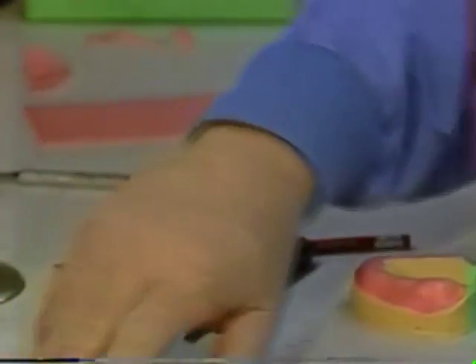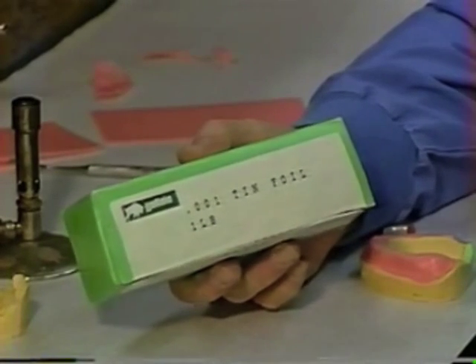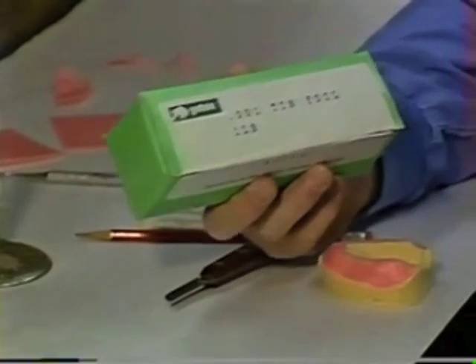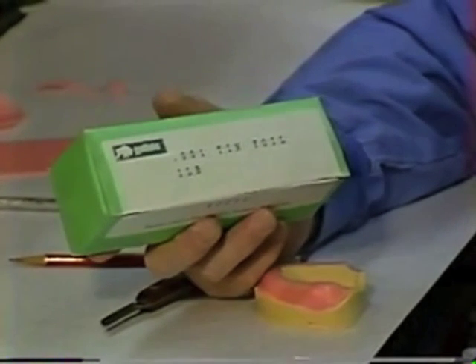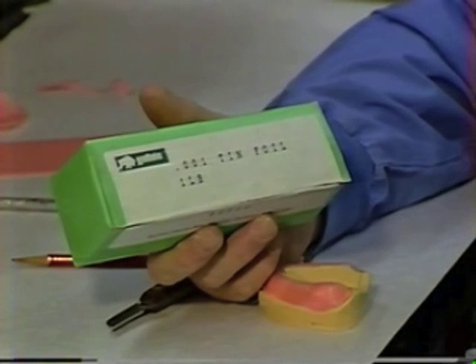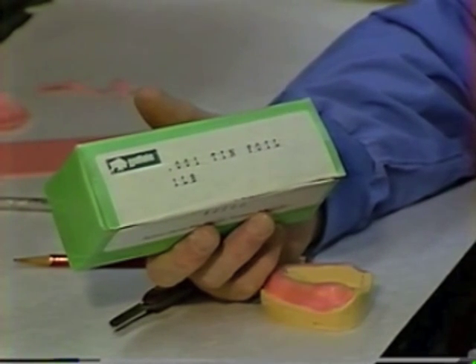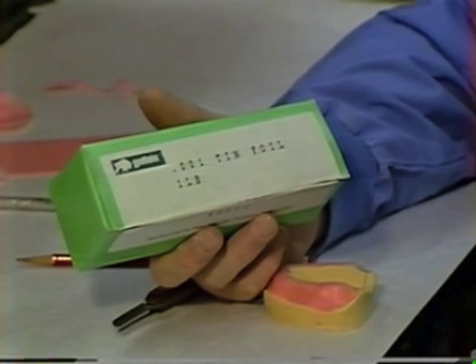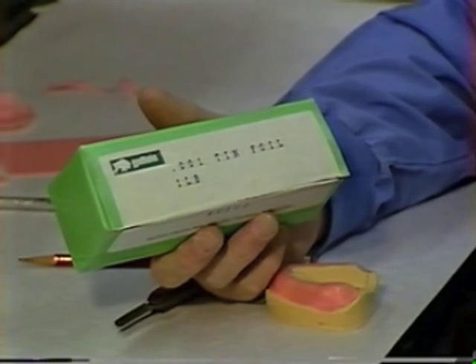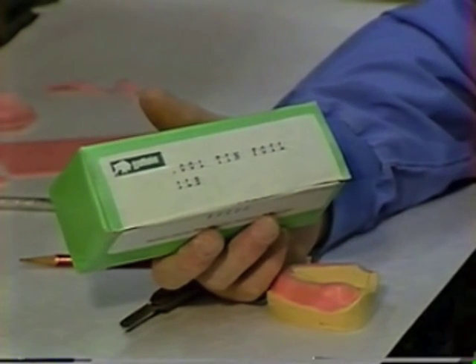We want to adapt some tin foil. I like to use .001 tin foil as a separator between the wax and the tray that we're going to make. The reason for that tin foil as a separator is that we do not want to pick up the melted wax onto the tray. As our acrylic resin sets, it has an exothermic reaction that creates heat, and that will melt the surface of the wax, and as it melts the surface of the wax, it will make the tray not very retentive to your impression material later on.